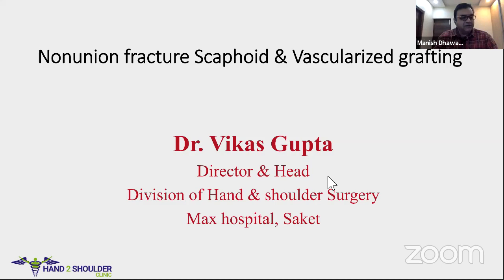Professor Bhatt, there is a question from the audience. What is the thickness of wire used for percutaneous fixation? They're talking of the guide wire? Yes, the guide wire which you use for percutaneous fixation. The guide wire is about 1.1 millimeter. And then you have a 1.5 drill bit, and the screw is 2.4.